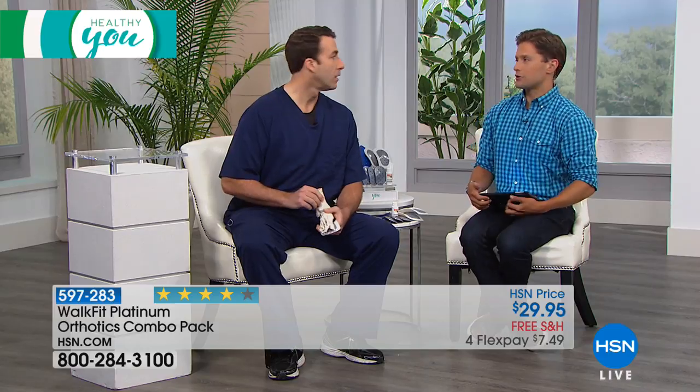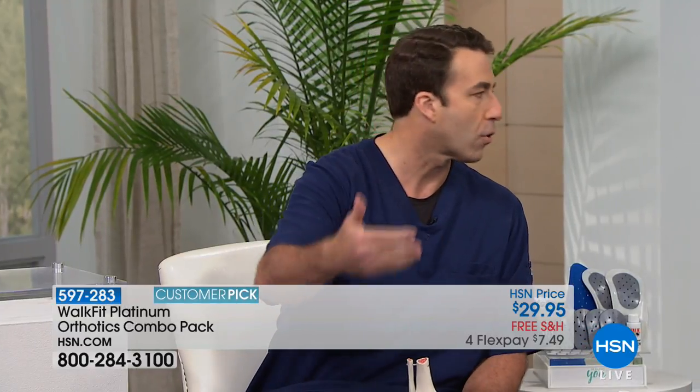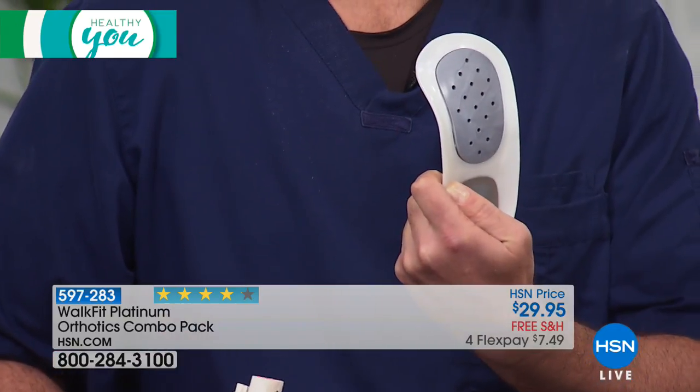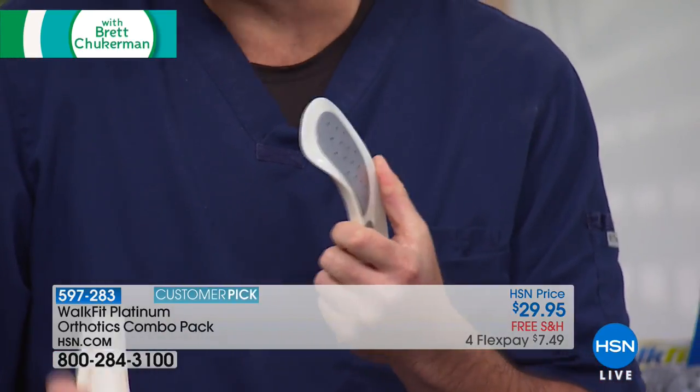We usually move two to three thousand of these in a single airing and there's about 1,200 to go around, broken up through sizes. Our registered nurse Matt Peters is going to walk you through the concept of orthotics and how and why this is better for your back, hips, and knees. It does require a break-in period — you're going to have to adjust to these over time, just like you would a new pair of shoes. You wouldn't go for a run every day with a brand new pair of shoes no matter how much you love them, and it's the same thing with your WalkFits.